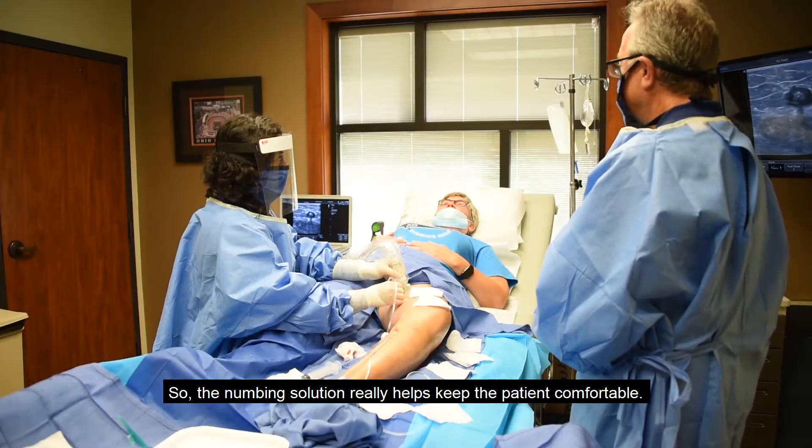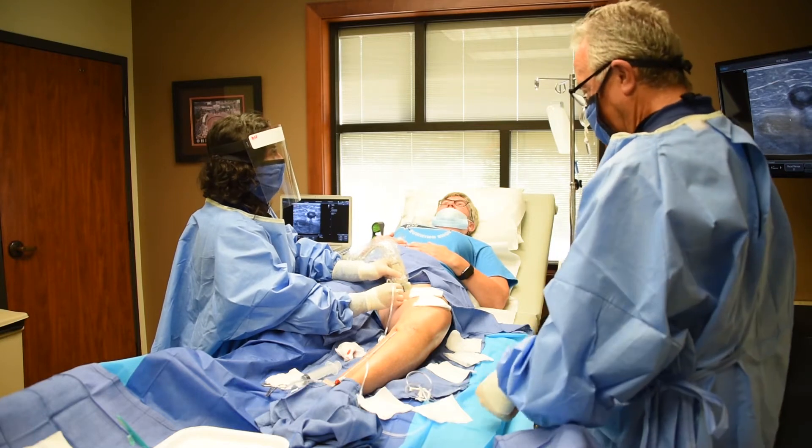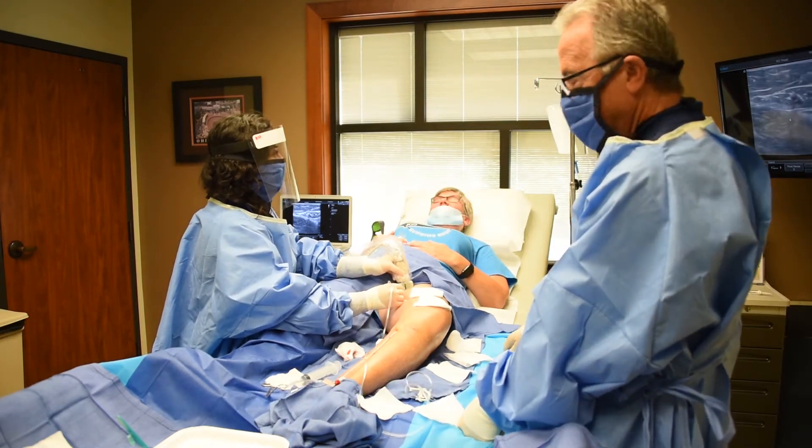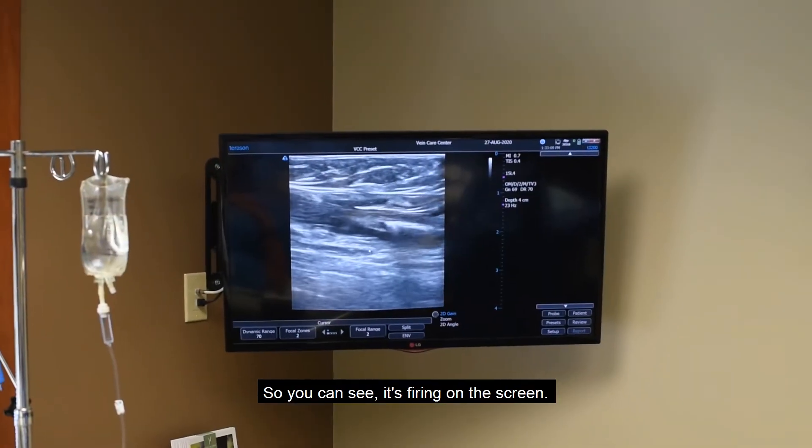The numbing solution really helps keep the patient comfortable, and of course we're talking to them — there's such a thing as verbal anesthesia. It keeps your mind off things. You can see the laser is firing on the screen right there.